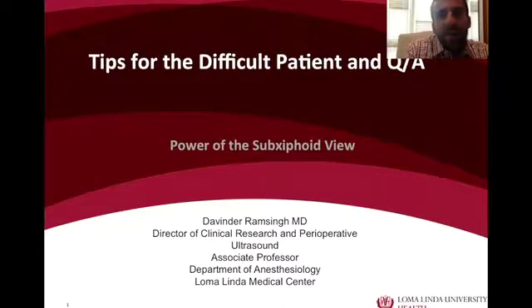Perhaps they have very large lung fields, or patient positioning is preventing us from being able to place our probe in those locations. The utility of the subxiphoid view really plays out in these settings because, again, the subxiphoid view is void of the lung fields more than the other examinations, except when there's a pneumothorax, and we'll talk about that.